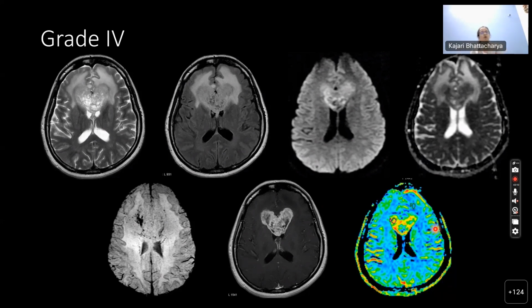So this is how radiologically we can say where the tumor is located, and what is the nature of the tumor, in the sense whether it's circumscribed or diffuse, whether it's an IDH mutant 1p19q non-codeleted tumor. And then what is the grade of the tumor, depending upon how it looks on T2, what is the diffusion signal, are there any bleeds present in the tumor or not, and what is the type of enhancement. So I hope that this little bit of explanation helps our residents.